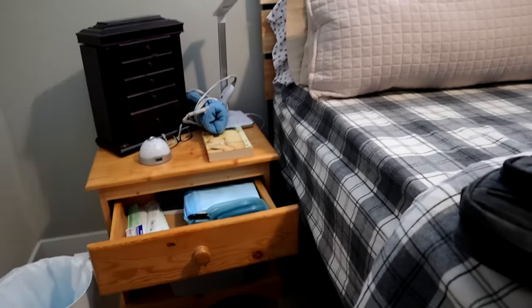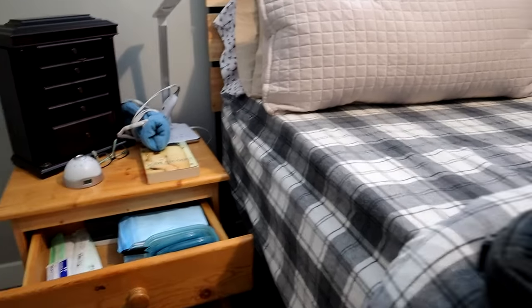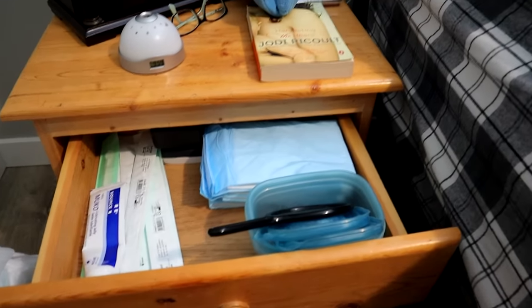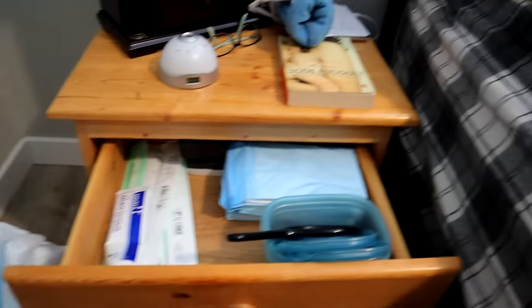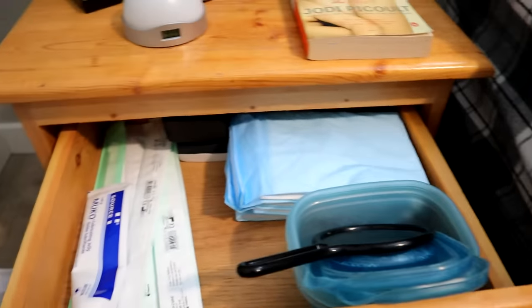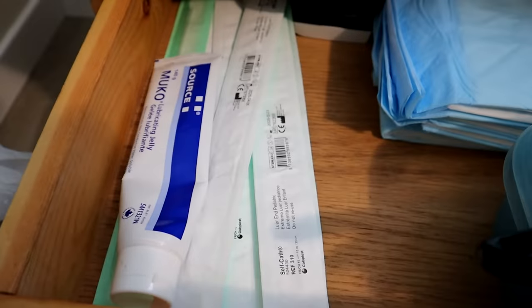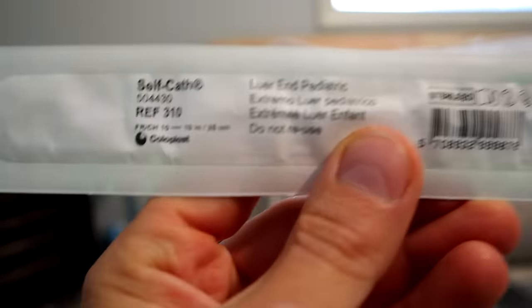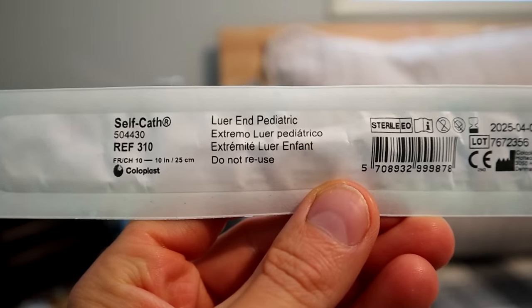All right, guys, so this is me wheeling up to my bed and showing you the drawer that I have stocked with the things that I need to go pee in the middle of the night. So I always have my containers there that I use — they're just like regular old GLAD reusable plastic containers. And then I have my lubricant, blue pads, and these catheters that are actually Luer End pediatric catheters.